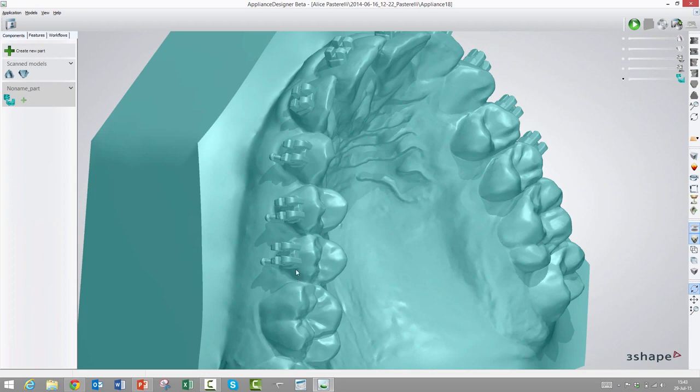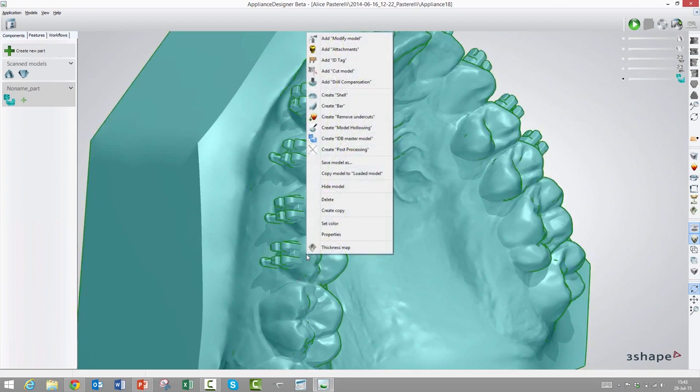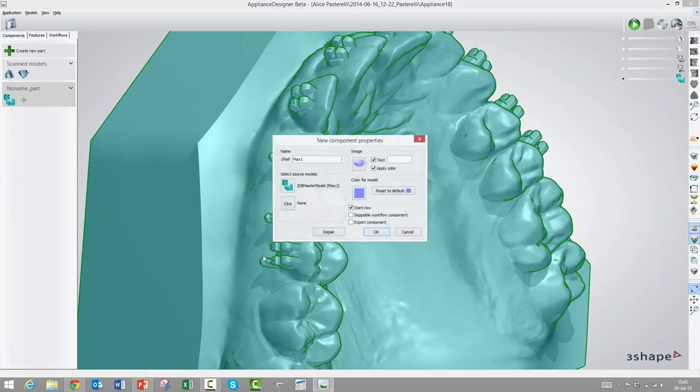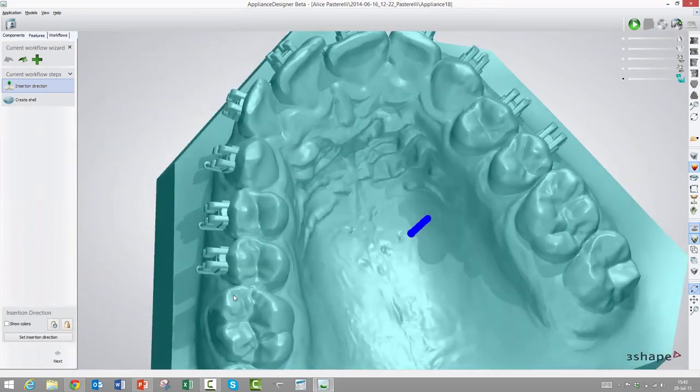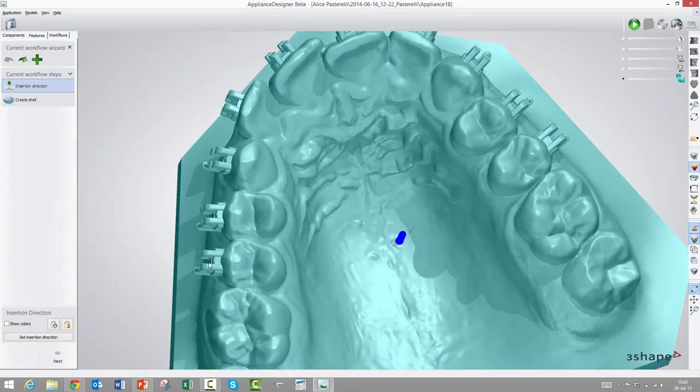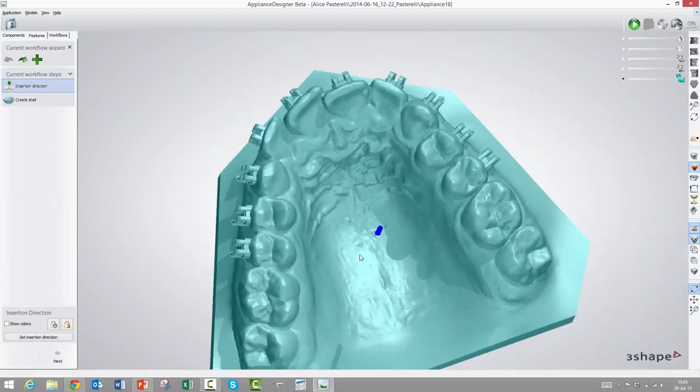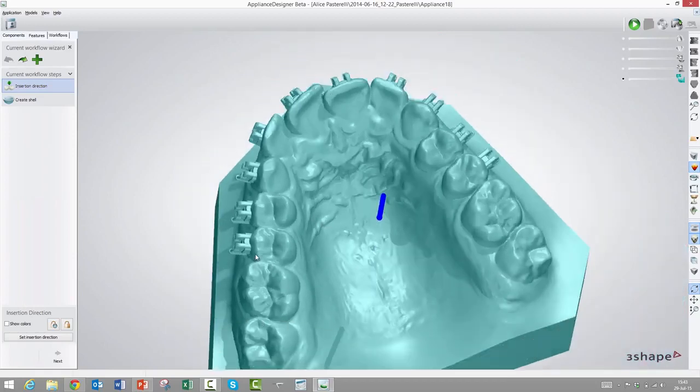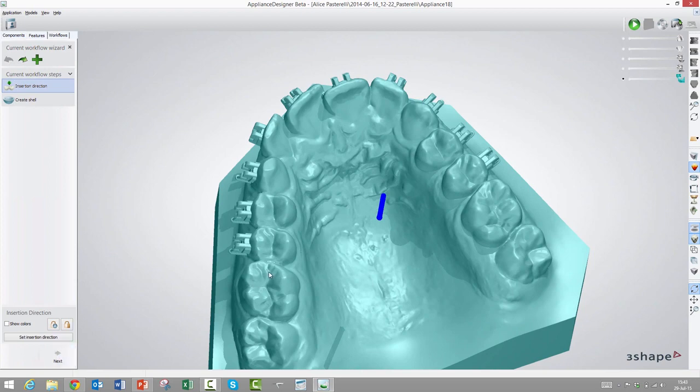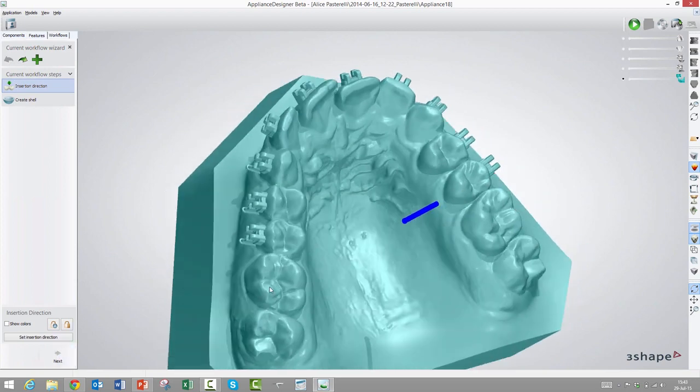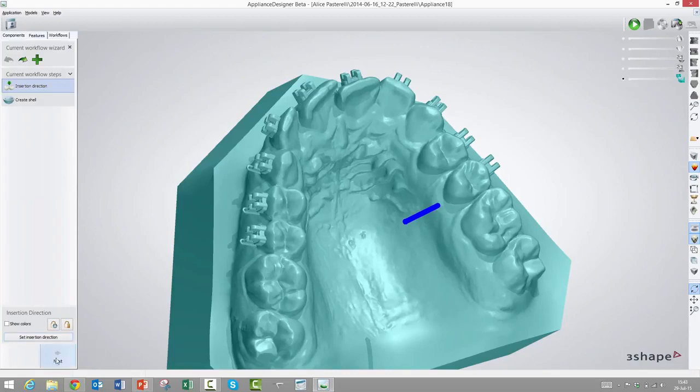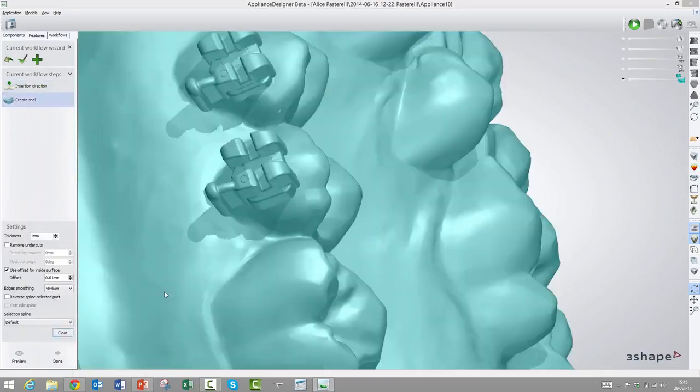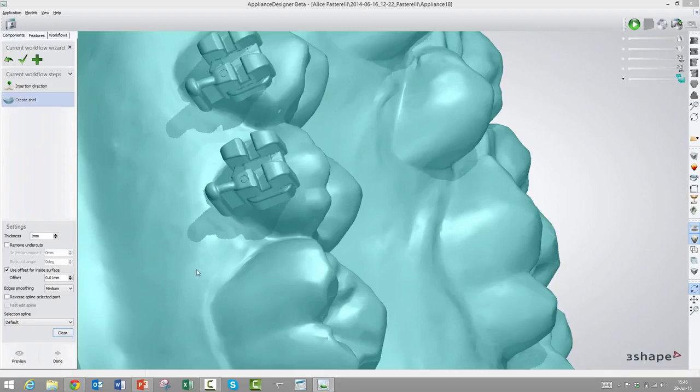Let's try to make this directly printed transfer tray. So we still need this, but this is only for a basis to design the transfer tray on top of. We will choose this, right-click, and then choose create shell. Now we will choose the insert direction, and that is not the insert direction for the individual brackets, that's the insert direction for the overall transfer tray. This looks fine, but we could adjust it if we wanted to set a different camera angle, press set insert direction, and then the insert direction will be adjusted to the camera view. But we will accept this one.